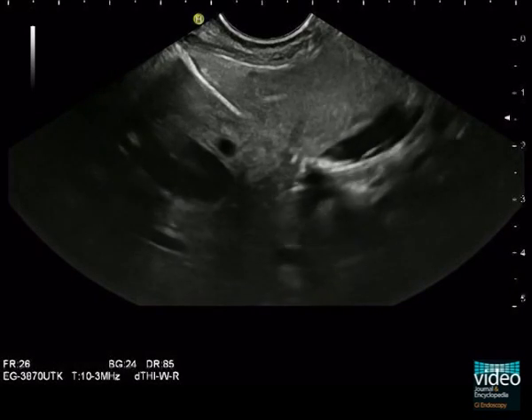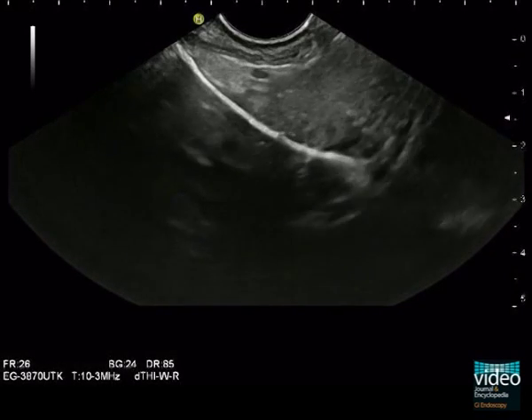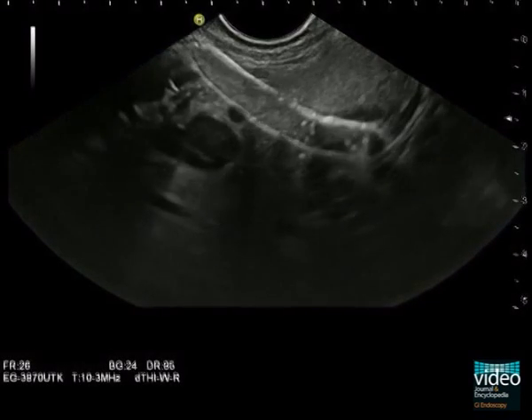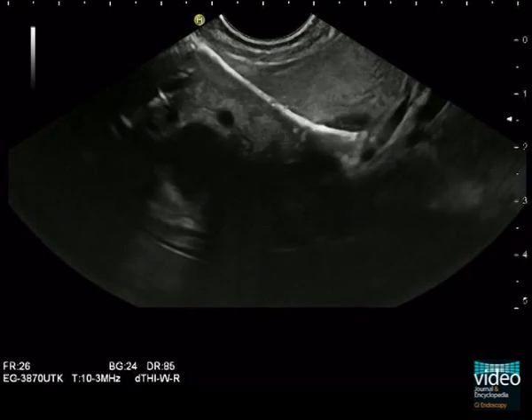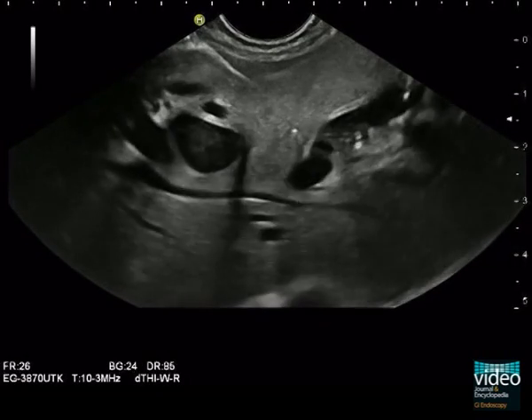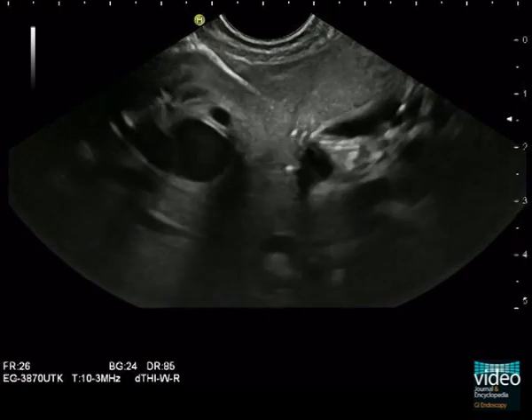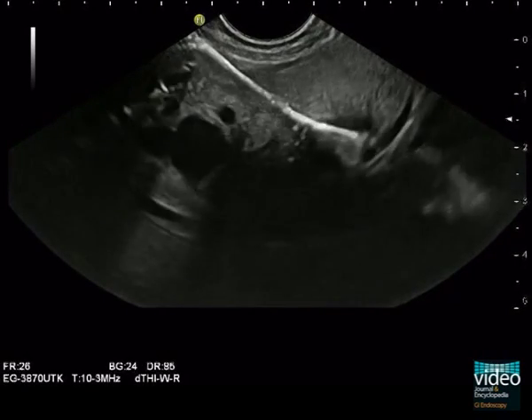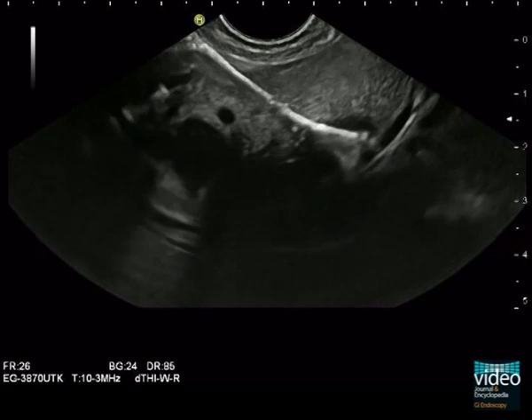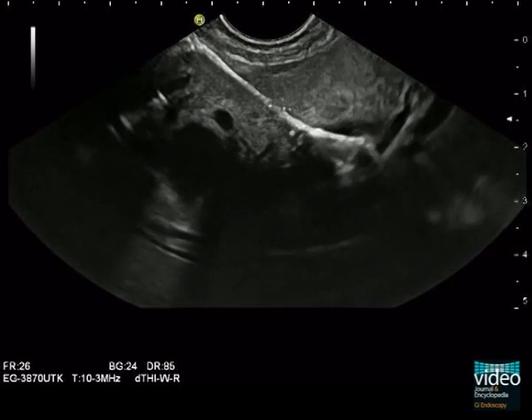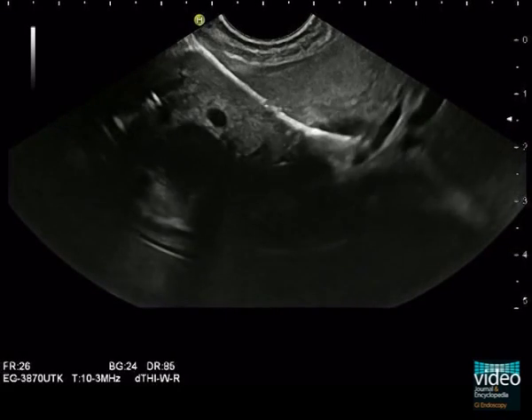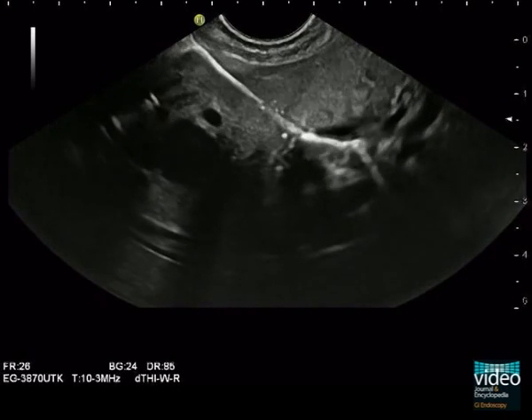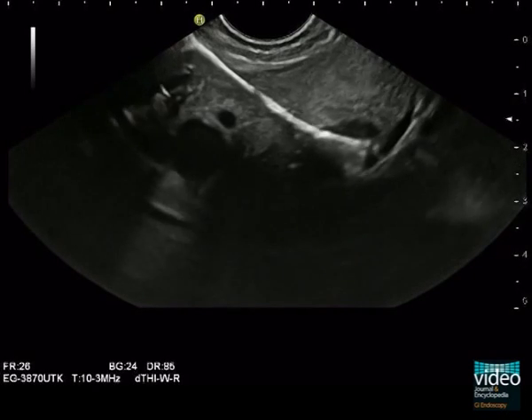The stent delivery system, armed with a fully-covered metal stent, is pushed over the guide wire to be watched closely with EUS and fluoroscopy. At the beginning of stent release, we see, under EUS guidance, the expanding distal end of the stent within the dilated bile duct.